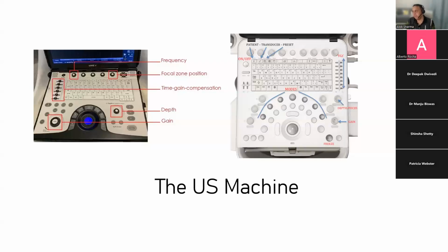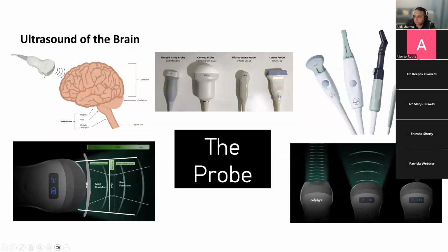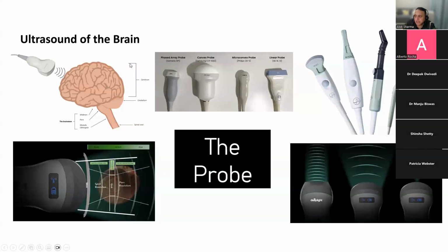Okay. So that's a beautiful question. Are you using a GE Vivid? Vivid IQ. Yeah, you're using the Vivid IQ. Okay. So a simple thing is, are you using a preset setting? Yes. So the simple thing that you have to do is you select your preset and it will give you an appearance of the brain. And your gain settings would have been set.